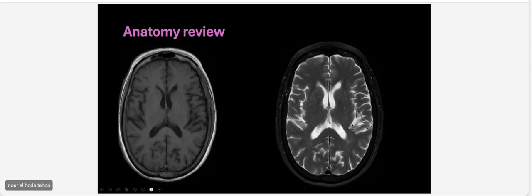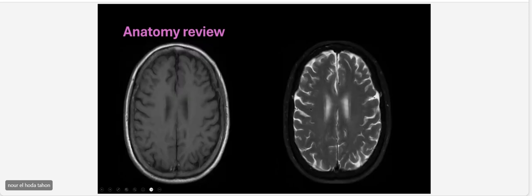And this is the end of the occipital lobe. The parietal lobe starts to appear here, and you can see the parieto-occipital fissure here that separates the parietal from the occipital lobe. And again, here is part of the sinus, and the scalp here. The flow is very good.